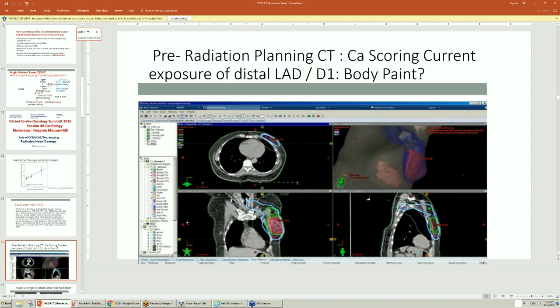So this is the contour map that is created for the breast, with the radiation as it's mapped and contained by IMRT. You can do the same thing for proton beam therapy or whatever radiation exposure you're using. If you're using a gamma knife, whatever that is, you can do this exposure and plot the major exposure, plot the minor exposure, and then the Compton effect.